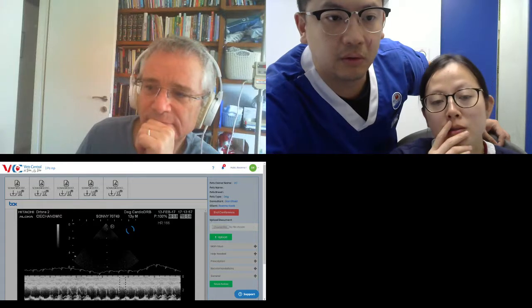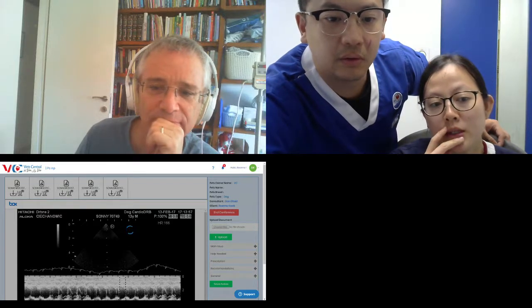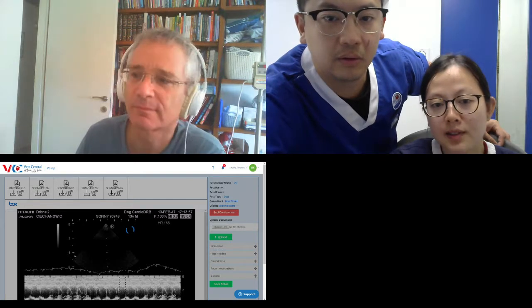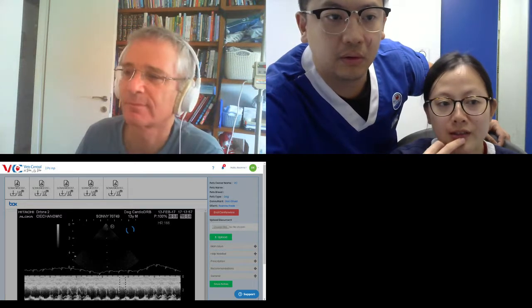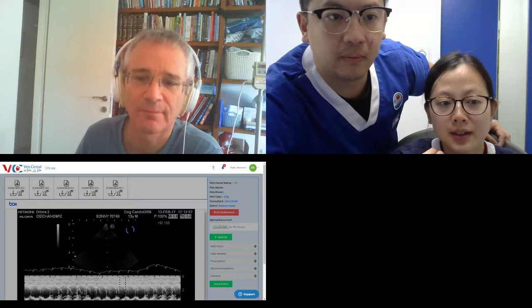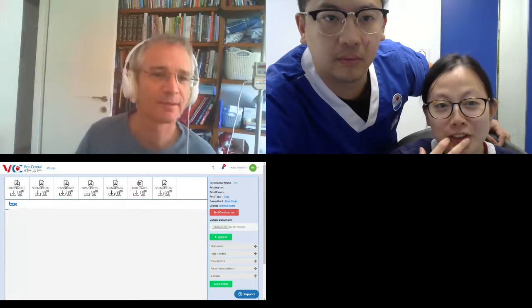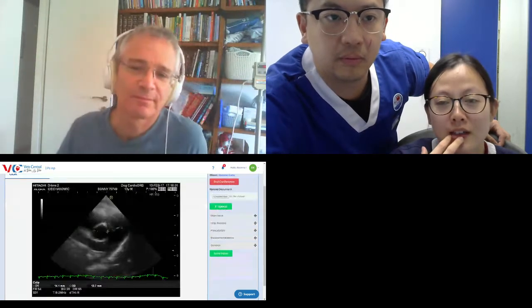Maybe what you do is you go through every image with me, just to prove that the left heart's fine and it's most likely pulmonary hypertension. Because I don't speak echo, so I think that's okay. Yeah, I will work with you.